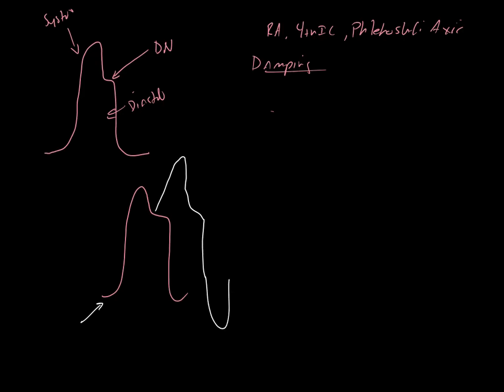So when we do our timing, typically we'll do like a 2 to 1 or 1 to 2. How do they put it? 1 to 2, I believe is, yeah. It's every other beat's augmented. So you're gonna have something that looks like this.